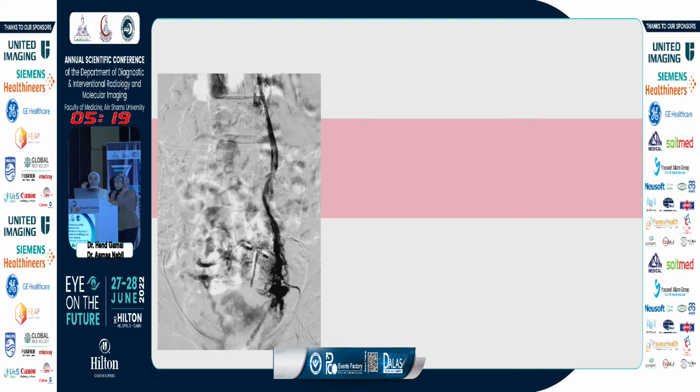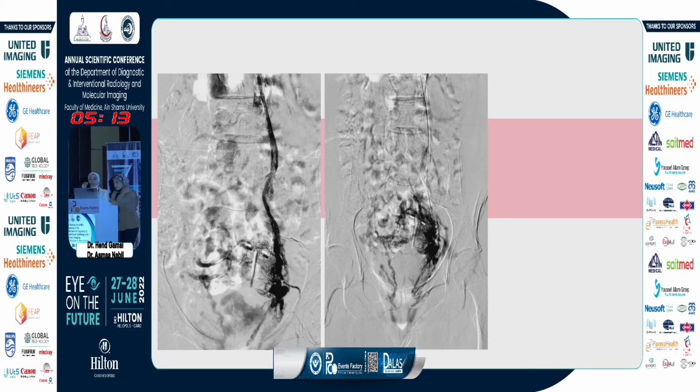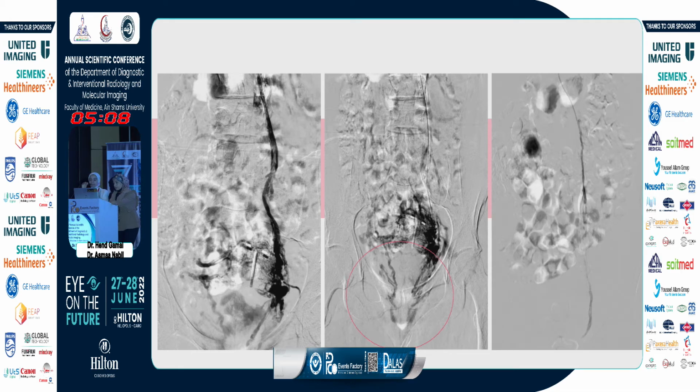Here we can see catheterization of the left renal vein, followed by superselective catheterization of the left ovarian vein, revealing a dilated tortuous gonadal vein and pelvic varices. Also, a communication of the vulvar varices through the vulvar leak point. The vulvar leak point is illustrated here. Embolization in this case was done using foam, and to the left we can see the control angiogram with non-contrast filling of the varices.